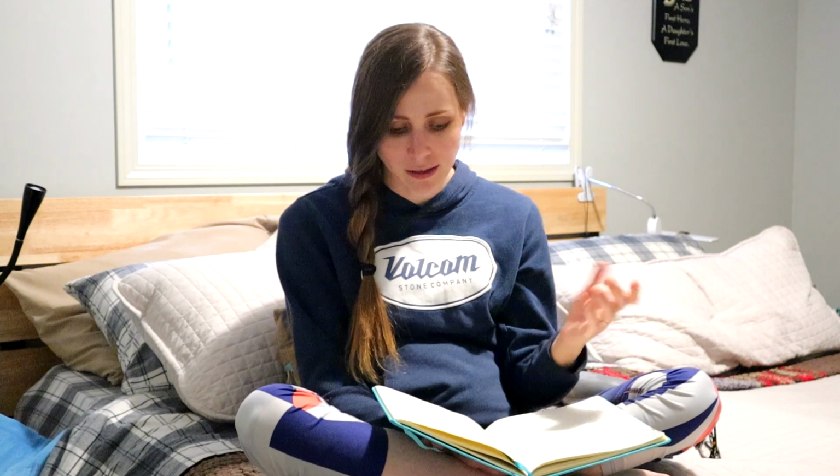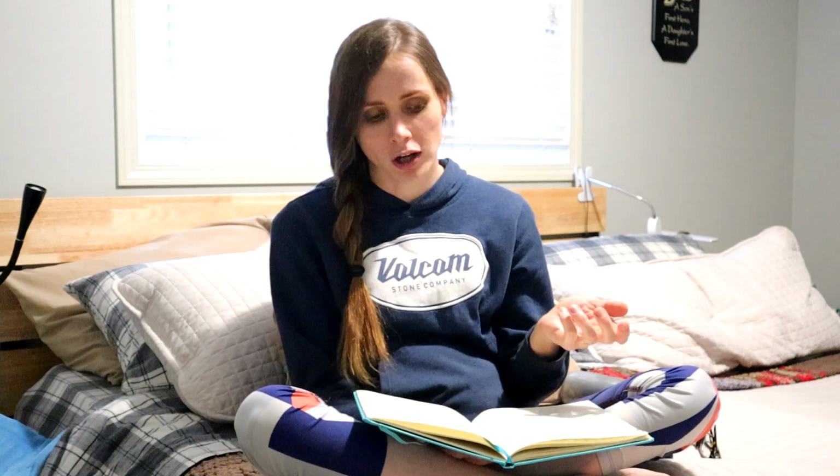You have less chance of incontinence than with intermittent catheterization because if you're doing intermittent catheterization, your bladder's full, and if your bladder spasms, then you can have incontinence. So you have less chance of incontinence with an indwelling catheter because there's no urine in your bladder. You can leak around the outside or around the catheter, but less chance of major incontinence.